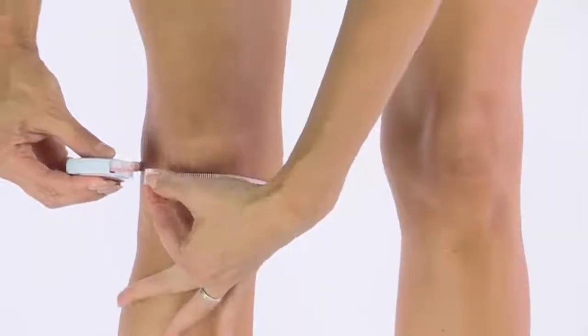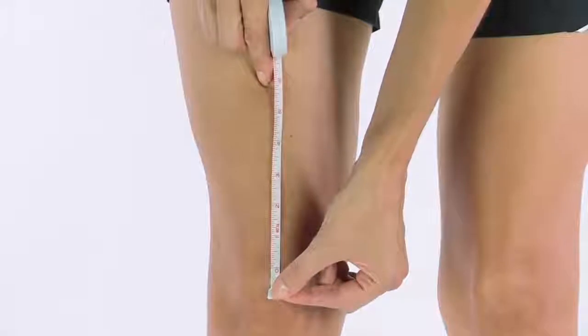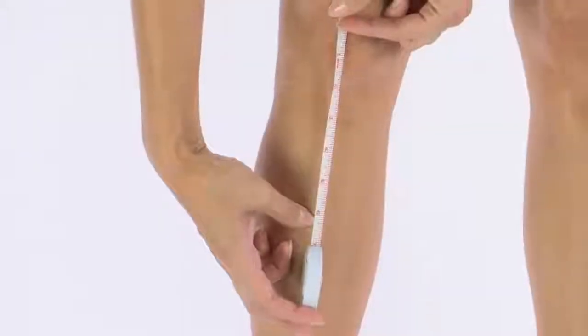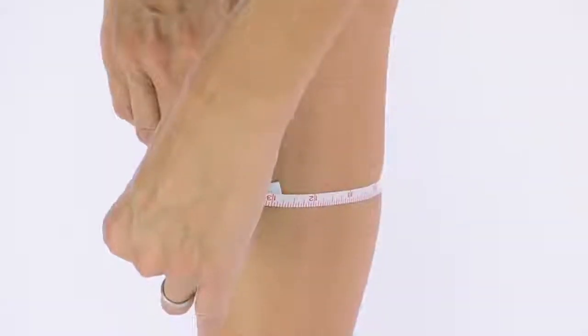First, measure the circumference of your leg at the midpoint of your kneecap. Next, measure six inches up from the center of your kneecap; at the six-inch spot, measure the circumference of your thigh. And finally, measure six inches down from the center of your kneecap; at the six-inch mark, measure the circumference of your calf.